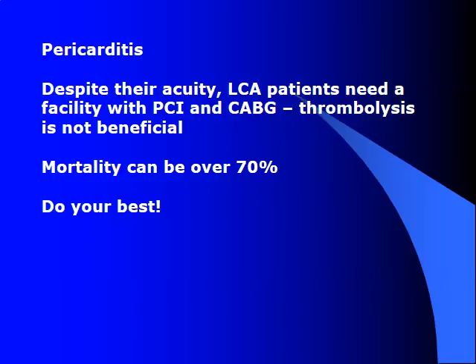Despite their acuity, left main coronary artery patients need a facility with PCI and CABG. Thrombolysis is not going to be beneficial. Mortality is over 70%, so do your best and transport at high speed to an appropriate facility. The key point to remember there: widespread ST elevation with elevation in aVR, in the clinical context of a patient that's hemodynamically unstable, could be a left main coronary occlusion, so treat these patients accordingly.